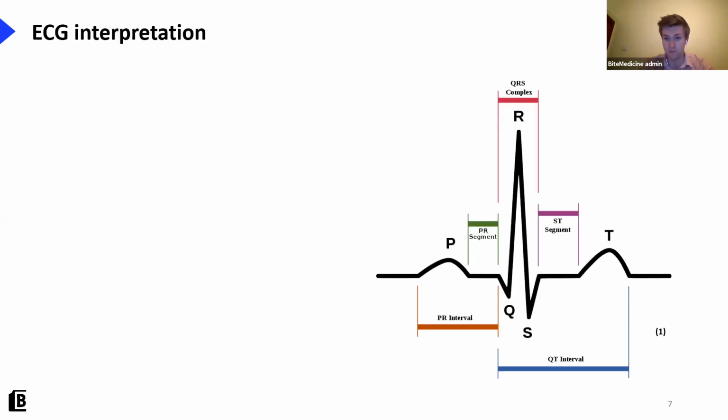So this is our QRS complex. So just familiarize yourself with the major regions because it will be relevant for today's session.